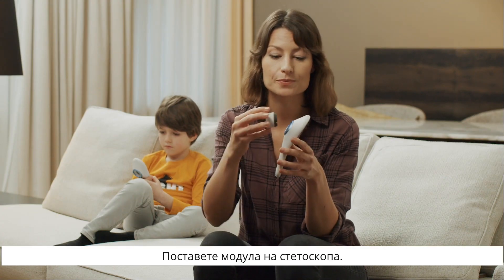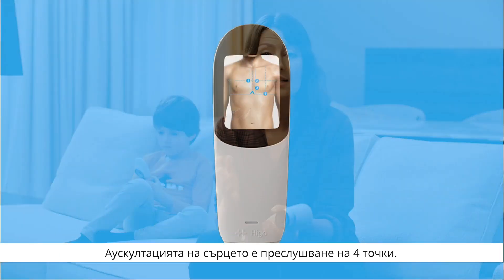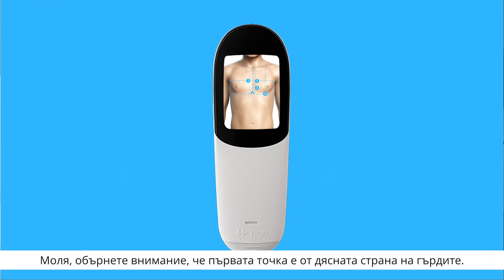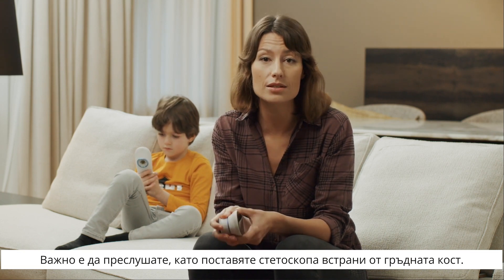Attach the stethoscope module. The heart is auscultated in four points. Please note that the first point is on the right side of the chest. It is important to auscultate with the stethoscope beside the sternum.